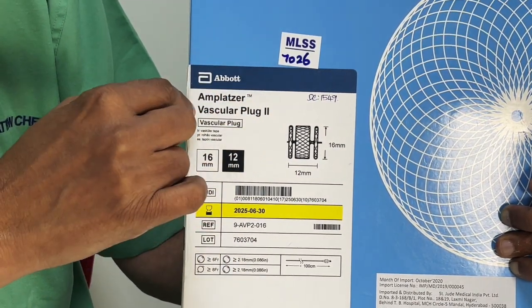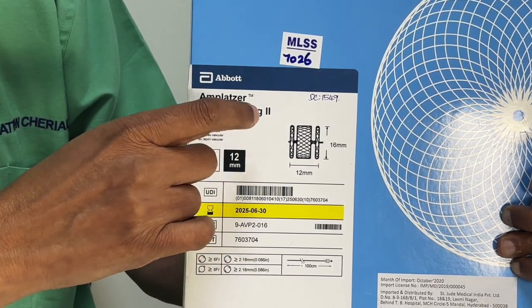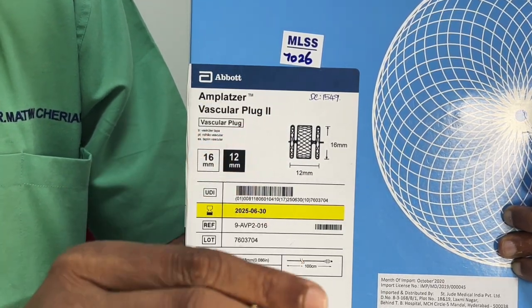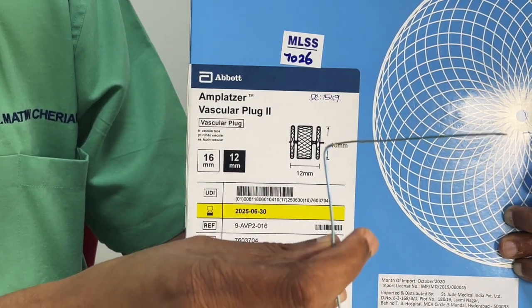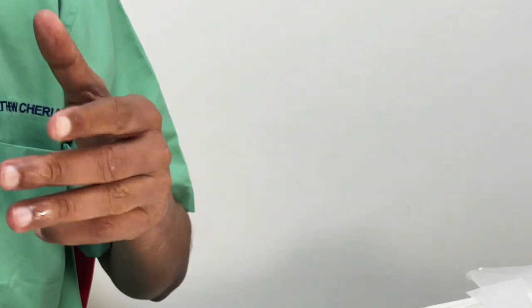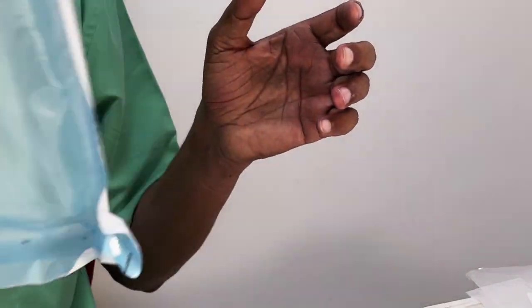There is also the Amplatzer plug 4, and the best part of the Amplatzer plug 4 is that it goes through a regular diagnostic catheter which takes a 0.038 wire like this. So remember that the Amplatzer plug 4 is a very, very good device, and I will show you an Amplatzer plug 4 now. Oh, this is another 2. I'm sorry. We don't have a 4 in the lab. Okay, so this can be opened, and I can show it to you.